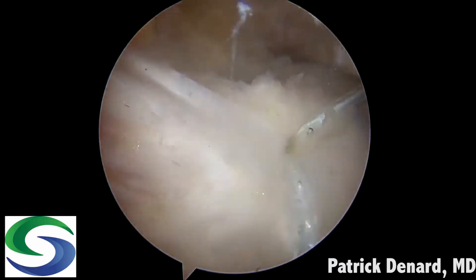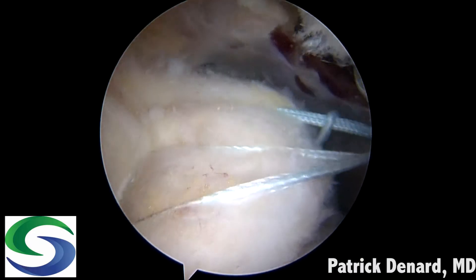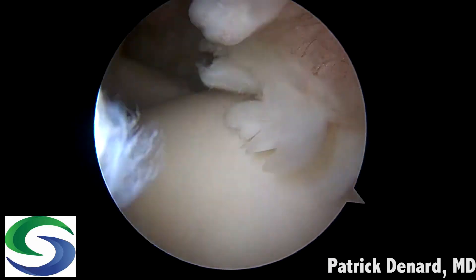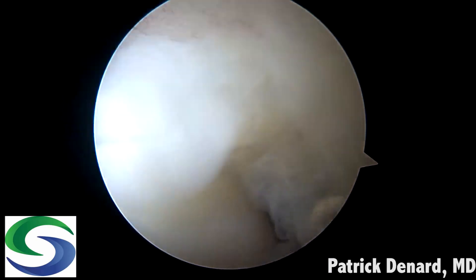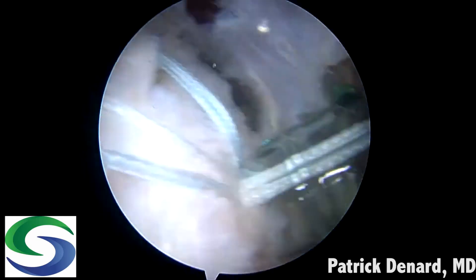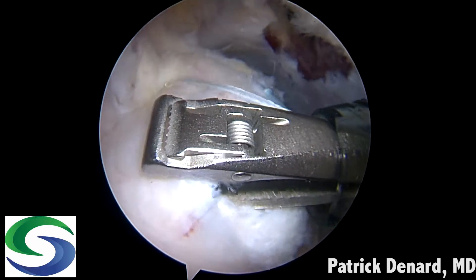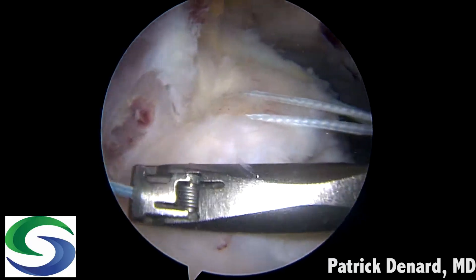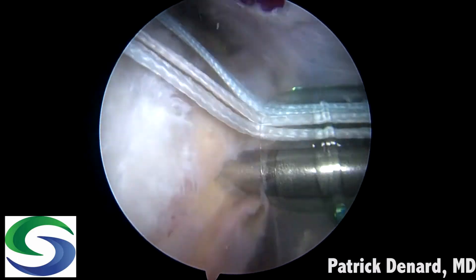This is the same concept as a medial double pulley, but in this case it's knotless. All those sutures are then taken out laterally. Going back to inspect in the joint, we can see the rotator cuff is nicely opposed to the articular margin. Using the cannula as a guide to determine lateral anchor location, we identify a potential dog-ear posteriorly, so another fiber link suture is placed as a half-racking suture.